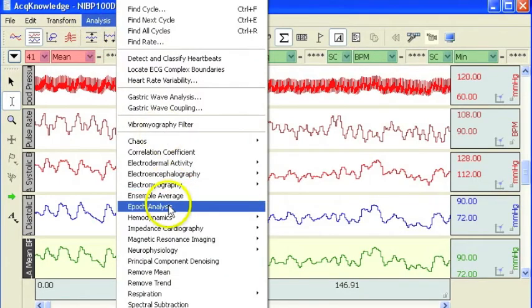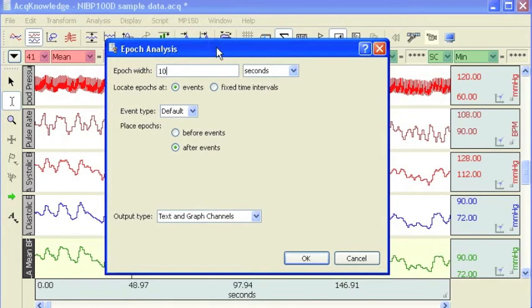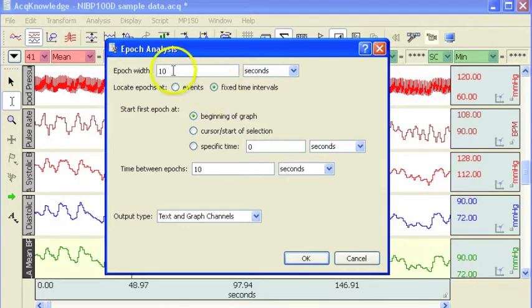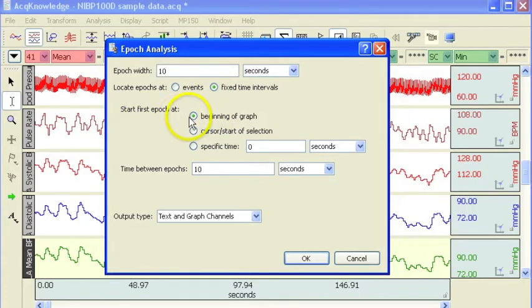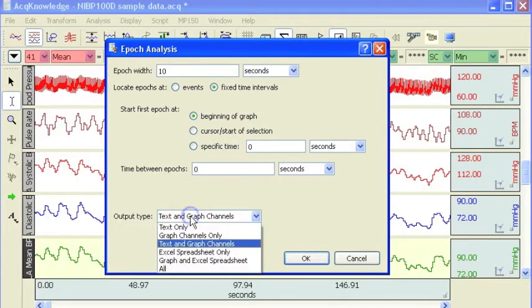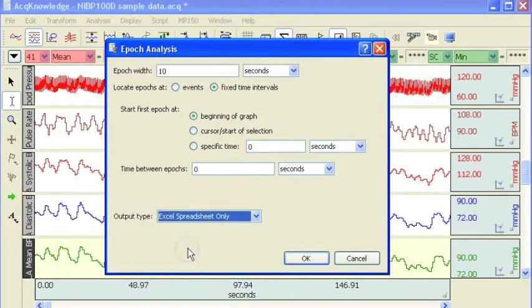Epoch analysis will allow us to automate this process. I am going to use a fixed time interval and I am going to take a measurement over a 10 second time window, and I am going to start at the beginning of the graph, so at time point zero, and I am going to take a measurement every 10 seconds. I am going to output my results to a spreadsheet.